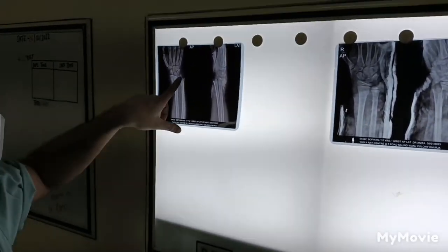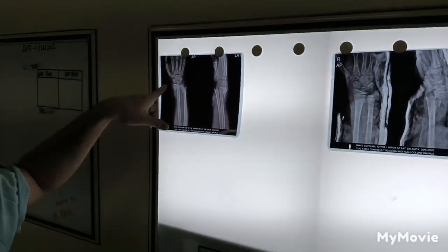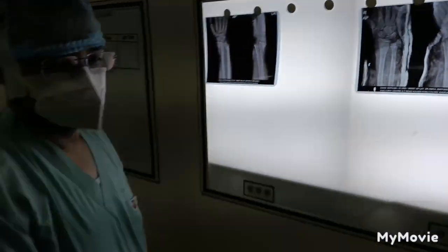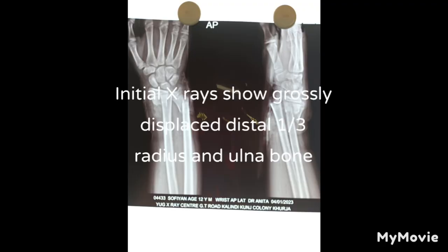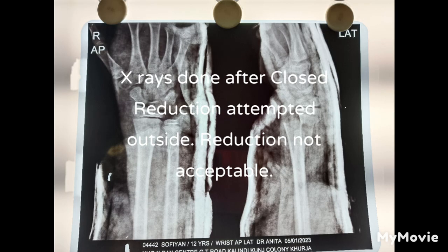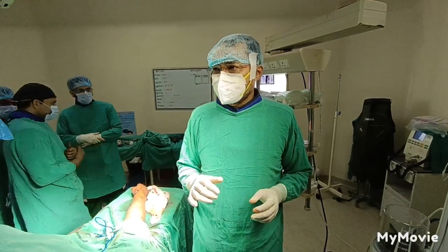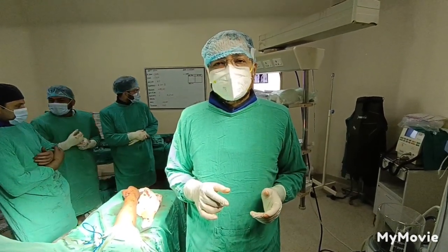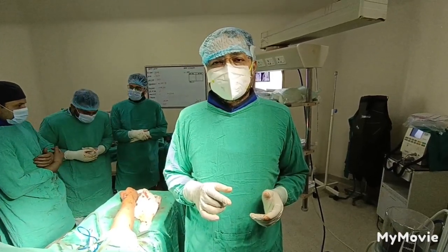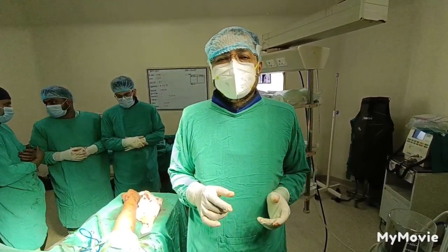After gaining reduction of the ulna, the plan is to fix the radius bone. Good morning. Today's fracture was a distal third radius and ulna fracture, one day old, with an impending compartment syndrome.